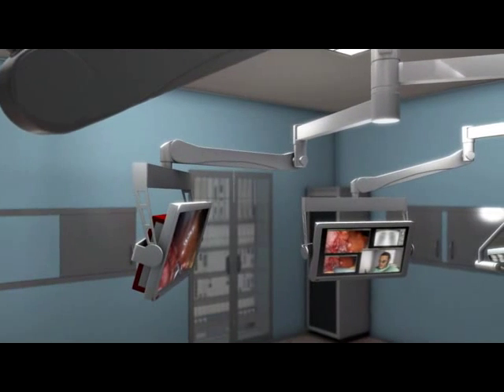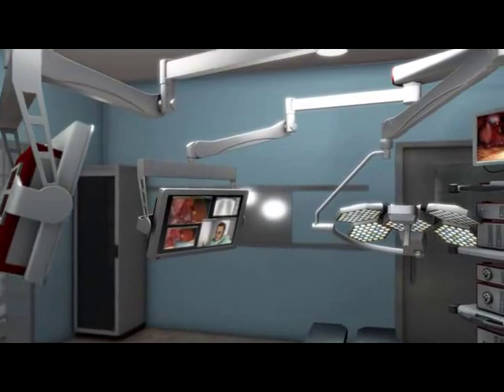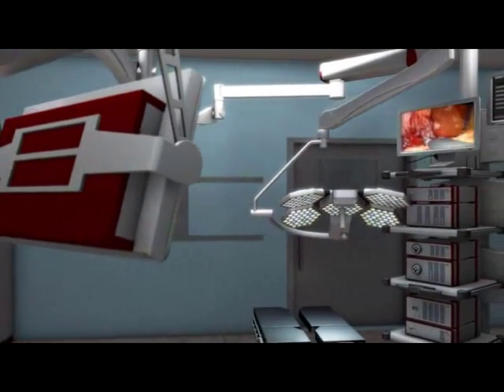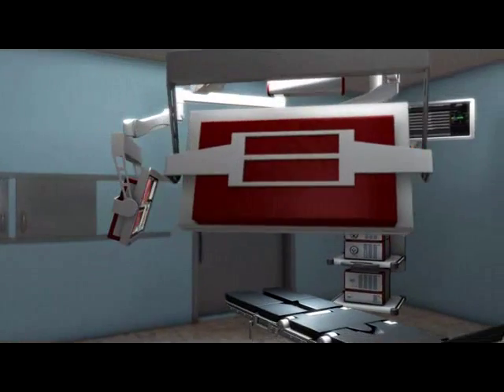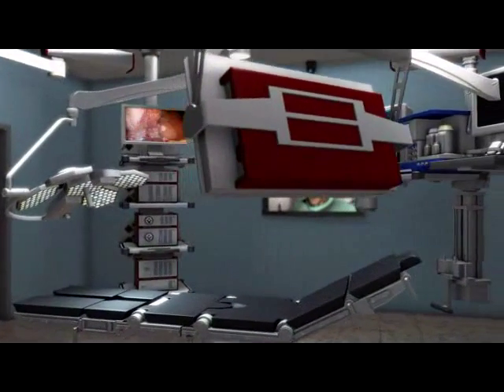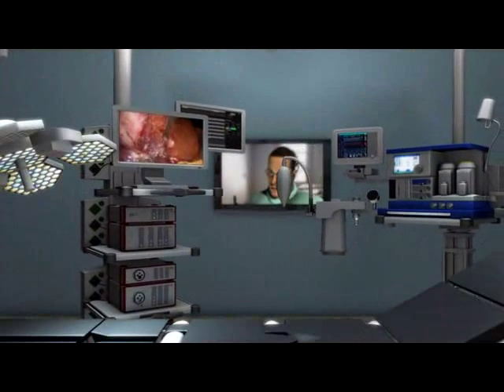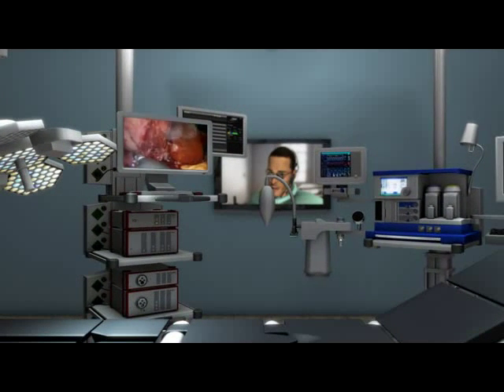This media control allows surgeons to switch the image signal to the preferred monitor and is independent of the system. The monitor can be positioned wherever the application requires. The same is true for ceiling supply units. The technology is always within reach, but never in the way.